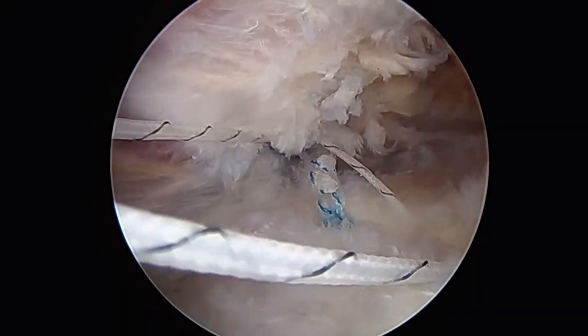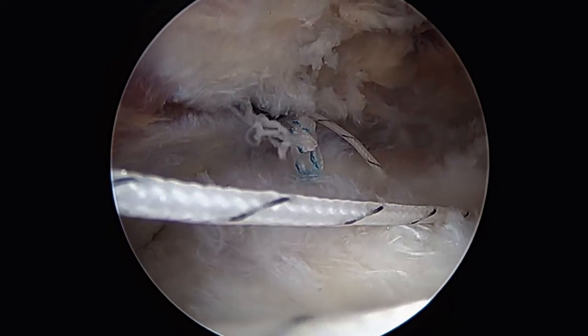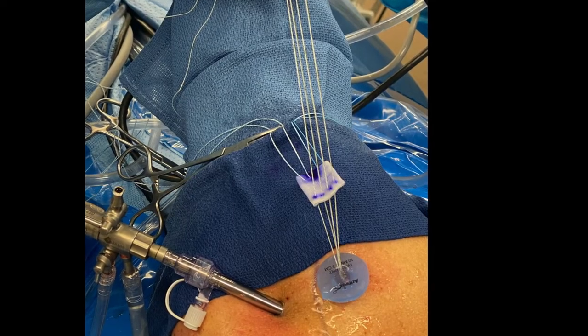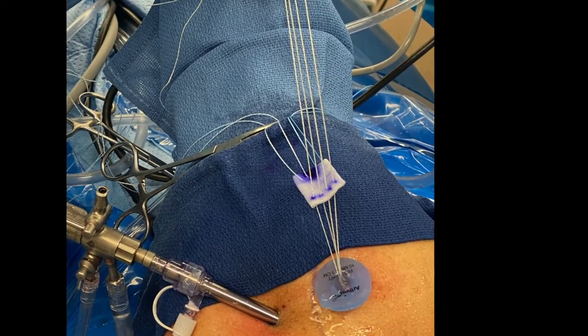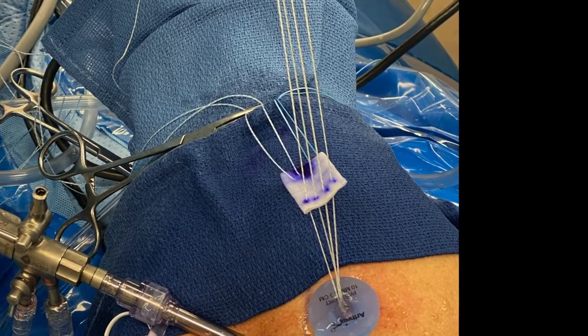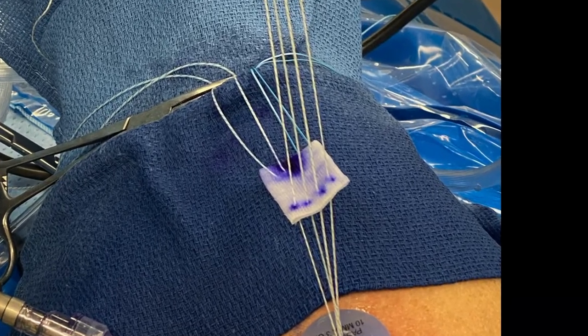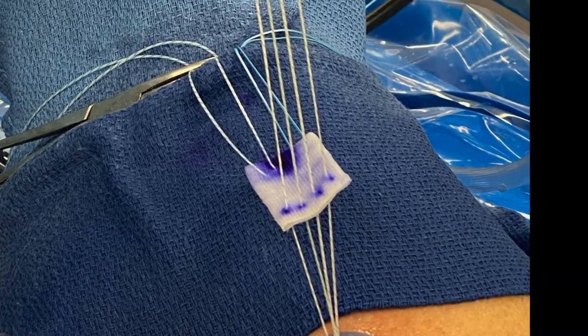One by one we'll bring each of the remaining mattress sutures from the medial row outside the body and pass them through the BioBrace in mattress technique. In addition, we have two sutures through the lateral graft which will be used in our lateral row anchors to load share and protect our repair.